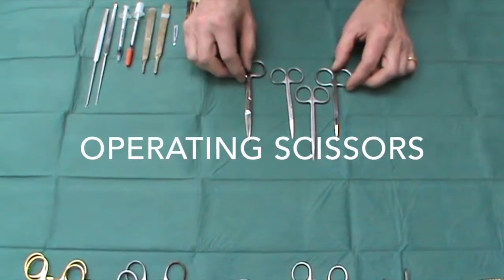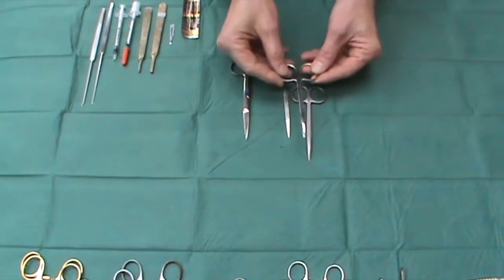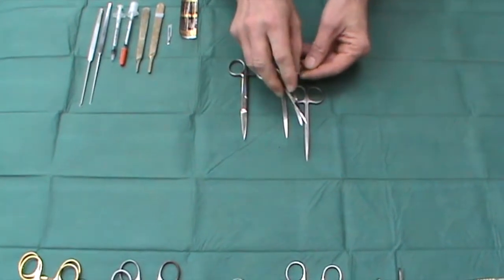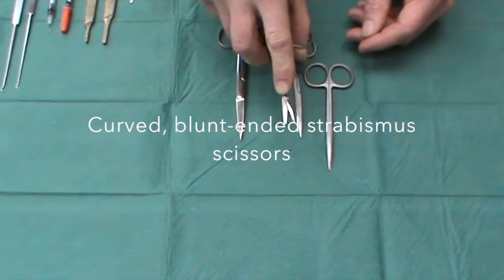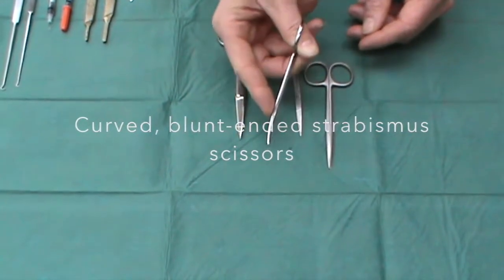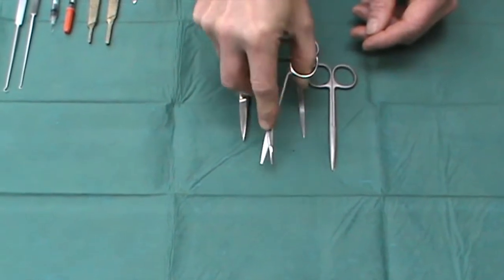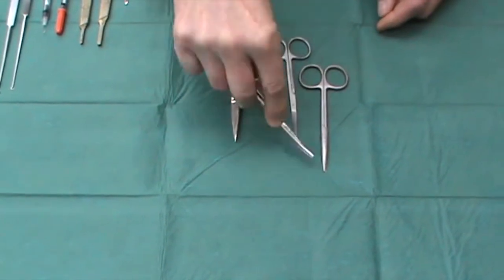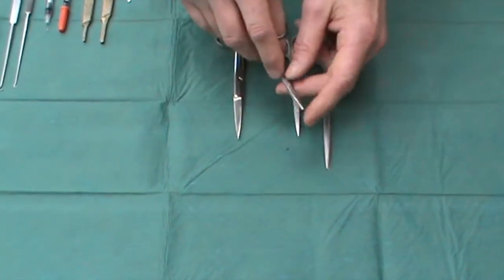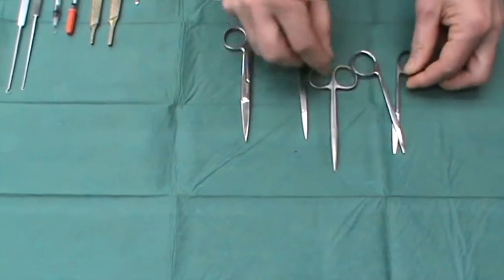When it comes to scissors, my favourite to find in any operating set is a pair of these curved, blunt-ended strabismus scissors. These are particularly good not only for cutting tissue, but also for working around cysts, or for undermining edges to help close them. Because they're blunt, you're unlikely to injure yourself.